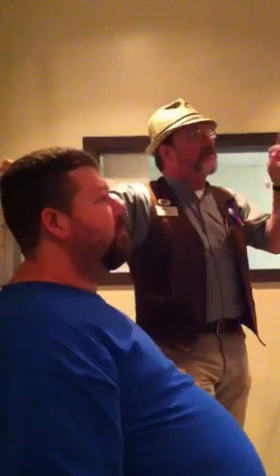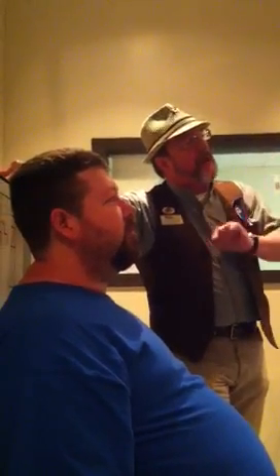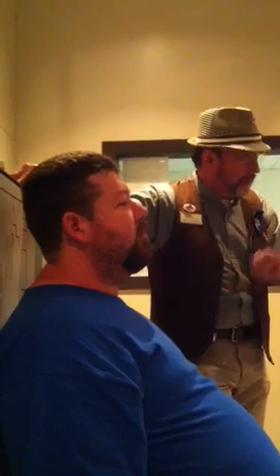2.5 inches above the glabella. So this is going to go in at the glabella. Instead of passing through the ear hole, out the foramen magnum, it's going to be passing through the zygomatic arches. So that's the whole idea of moving the entry point.